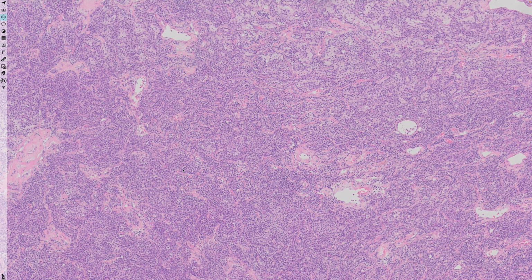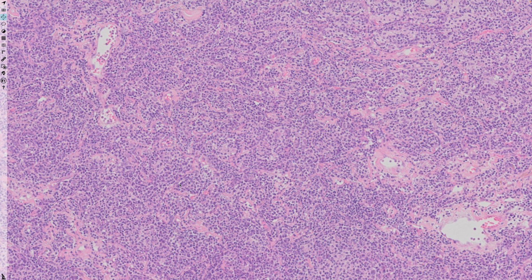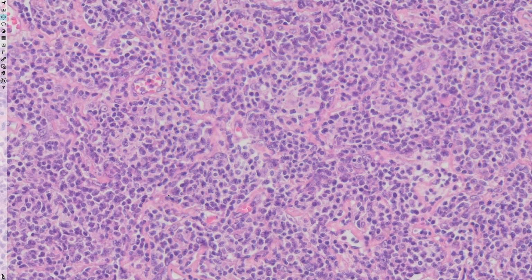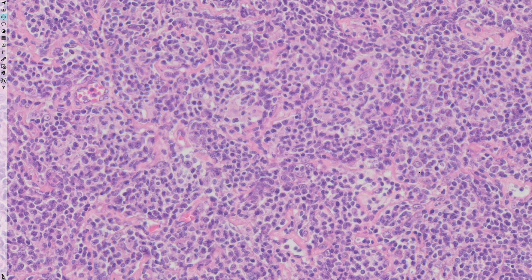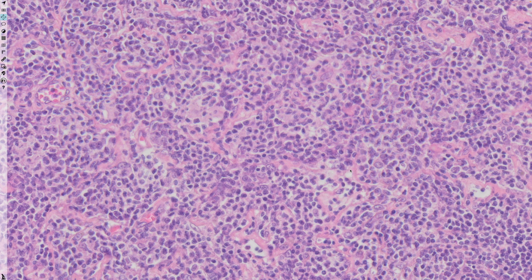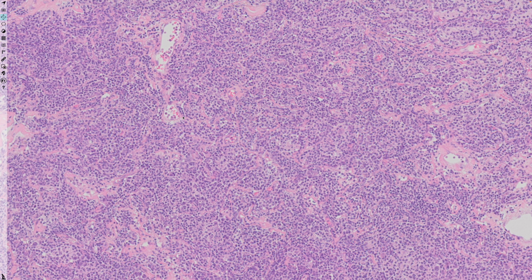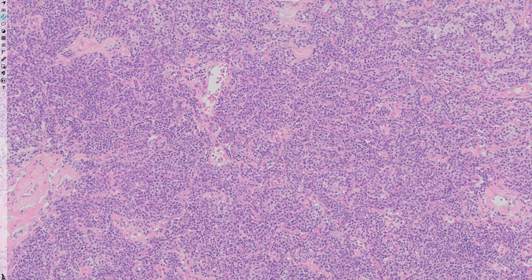lymphoid proliferations are predominantly small, and they are composed of these cleaved centrocytes, and we also have intermingled large centroblasts. So these are the centroblasts, and the ones that are smaller, the cleaved cells, are centrocytes. In the background, what we also notice are these sclerotic bands, and they are surrounding these nodular areas over here.